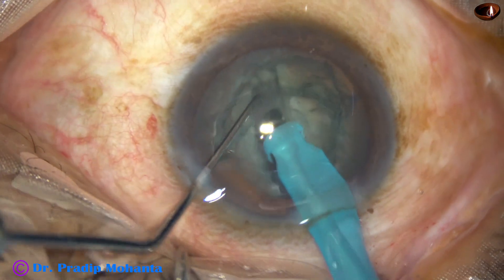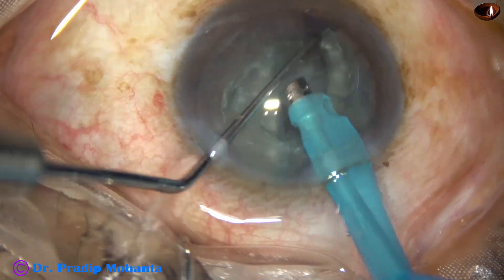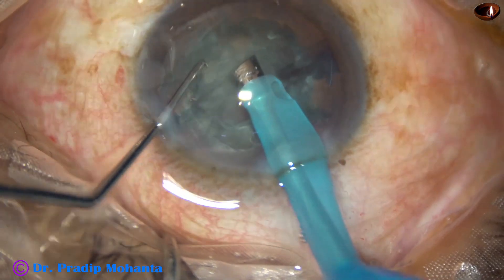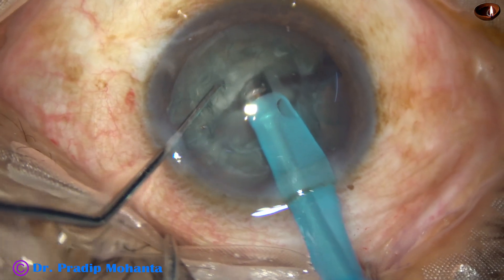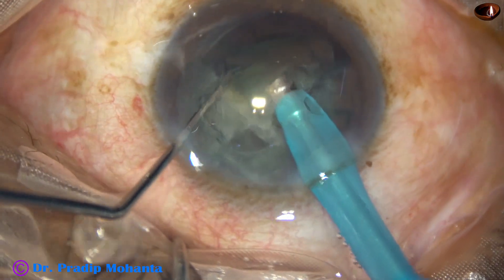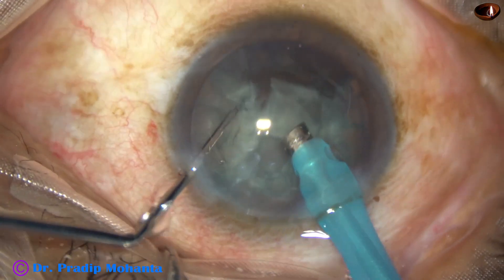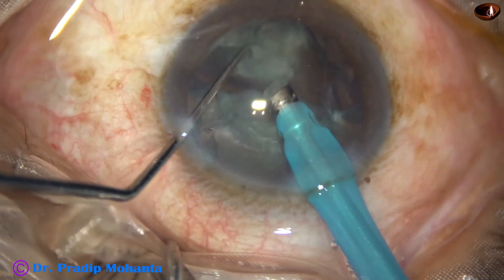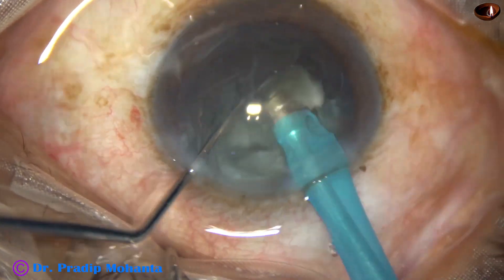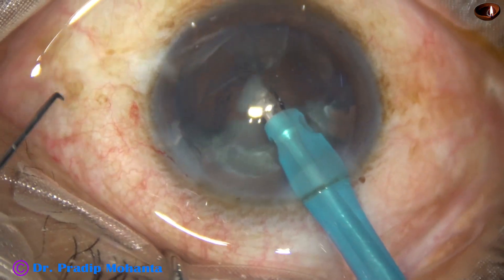Now we have some faint red glow. The nucleus is divided into two hemi-nuclei. To hold the hemi-nucleus, we must not try to hold the superficial upper part — we go to the middle part, hold it, and chop it. We must apply adequate vacuum, but not too much. Since the foot switch is linear, we must train our foot to go to the optimum position so that the vacuum created is optimum.